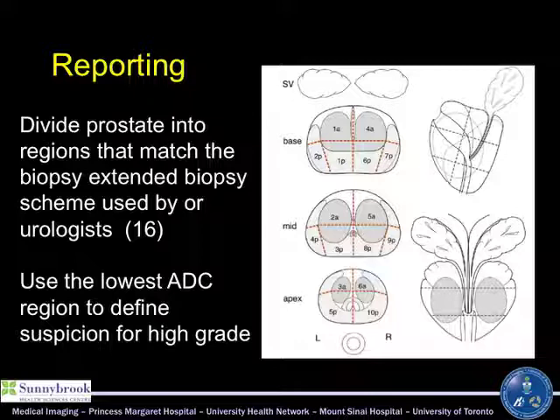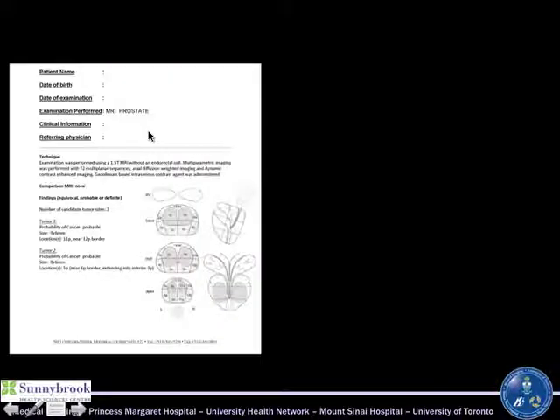One approach that's being taken is to develop a more detailed division scheme within the prostate. And one of the key things here is this line. This is an 18 millimeter into the prostate line, where most of the time the needle doesn't go for transrectal biopsy. So you know that you've got a deep tumor past that 18 millimeter mark for your biopsy if we identify this. And I'll show you what kind of report we're generating at one of the clinics I'm working with. So this is what the report looks like. I actually put screen captures on the report for this as well.